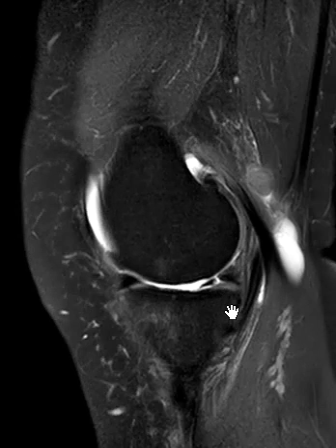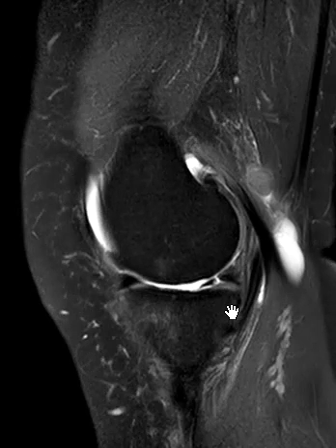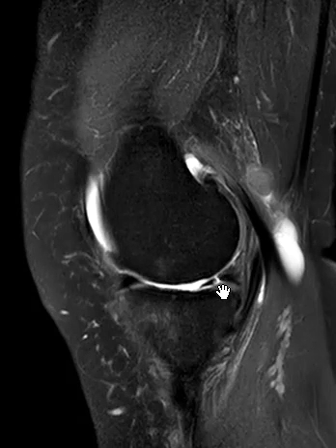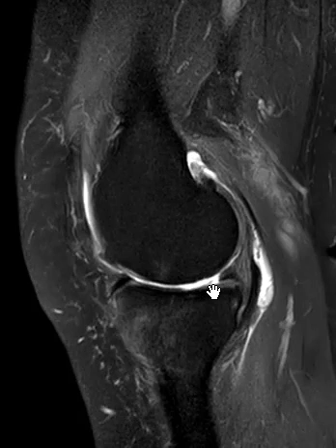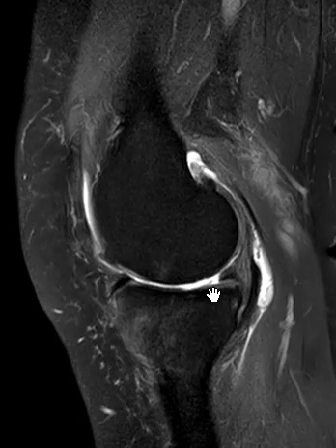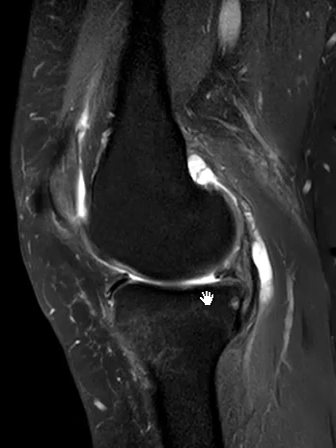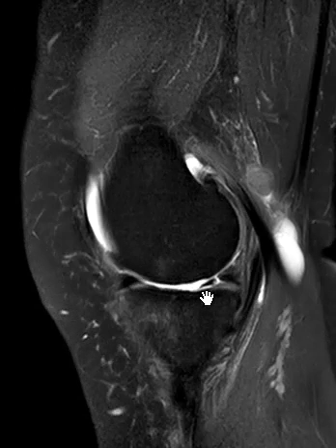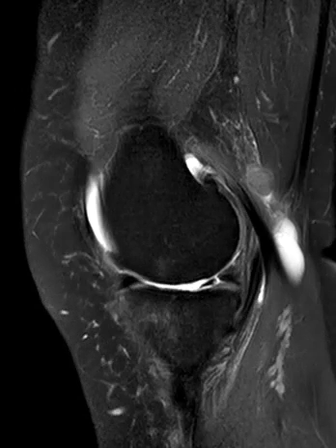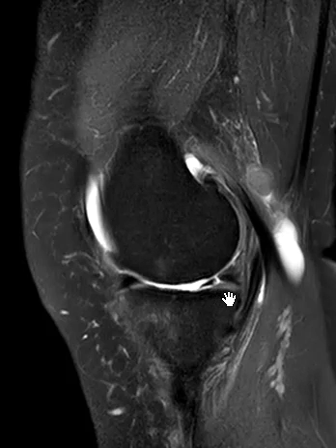If we follow this towards the central part, it looks like in the middle third going into the inner third, and the next cut over, it looks like the inner third is blunted. So the question is what kind of tear is it — and it turns out this is a parrot beak type tear.